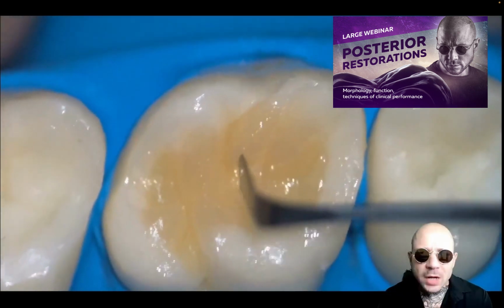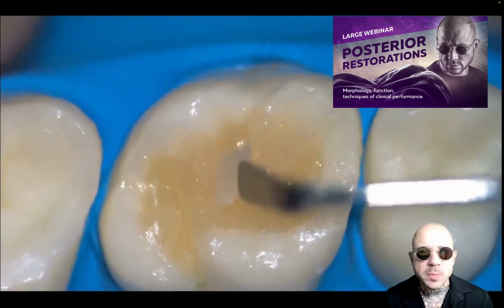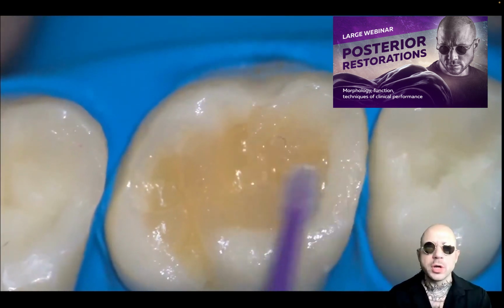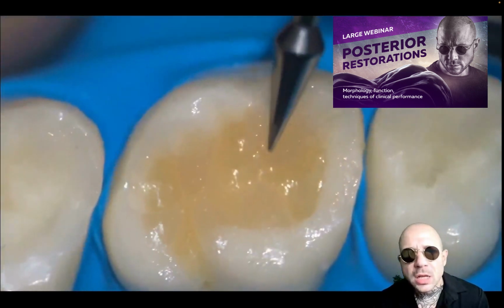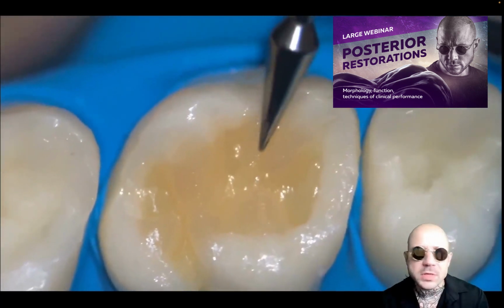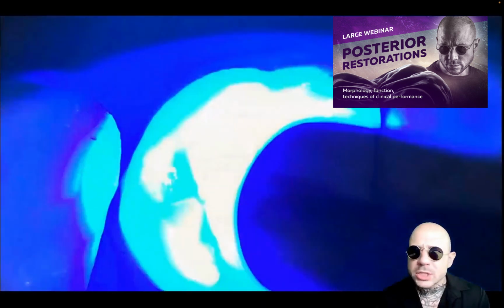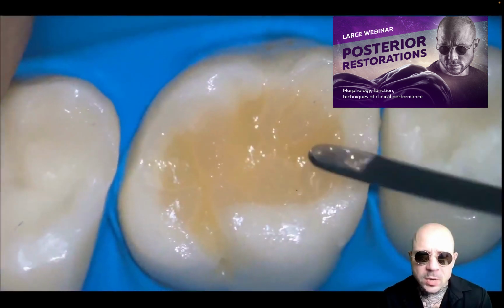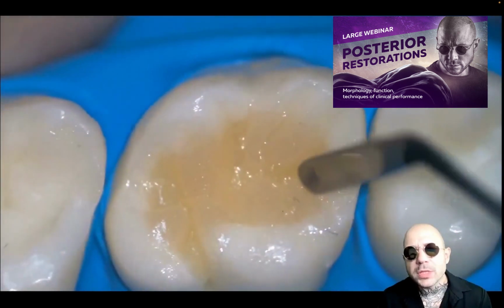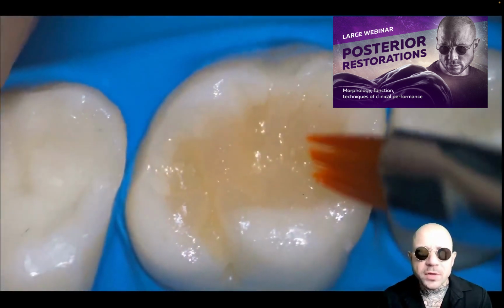Once again, you should not follow some specific sequence and reproduce some particular ridges first. Just do the ridges you feel more, the ones you understand at first, and if there is some area which is not very understandable for you, just leave it as it is, and start to work with some other areas that are more understandable, that you feel better.